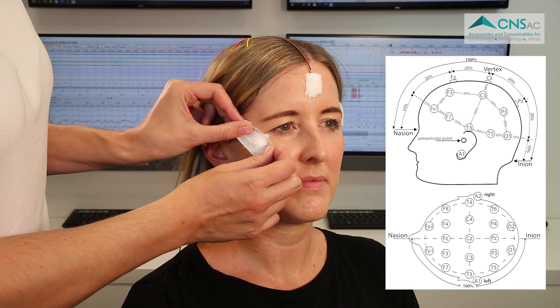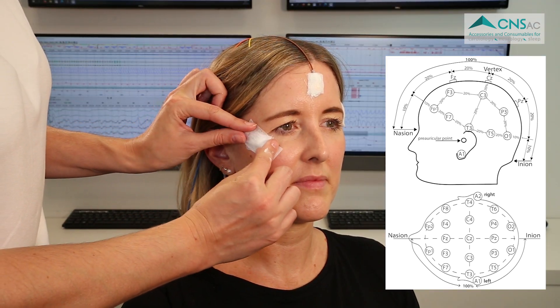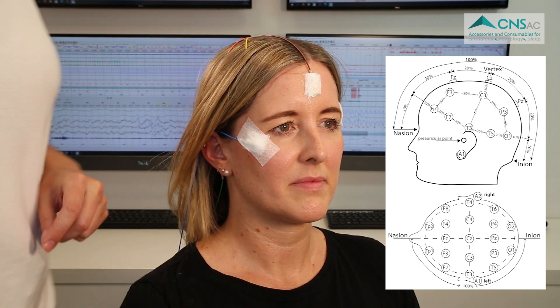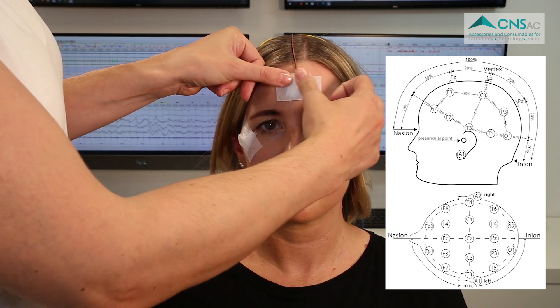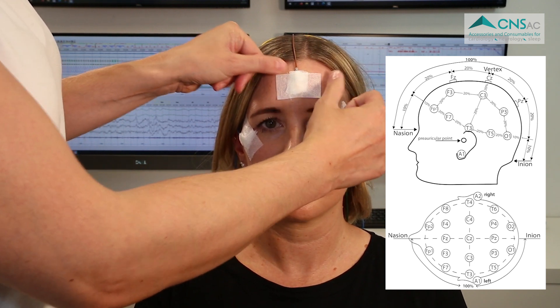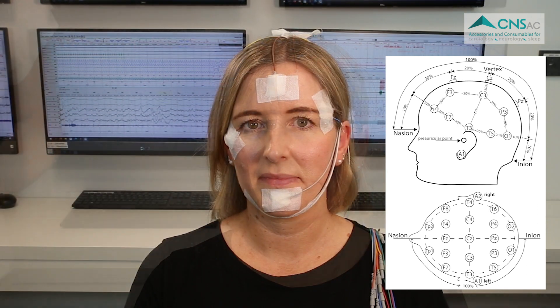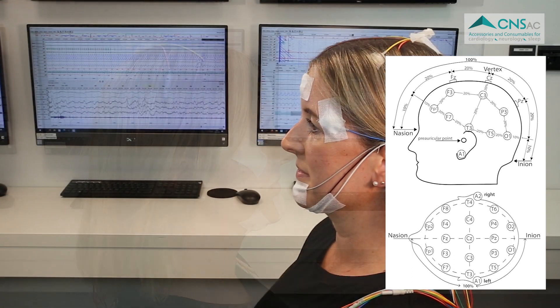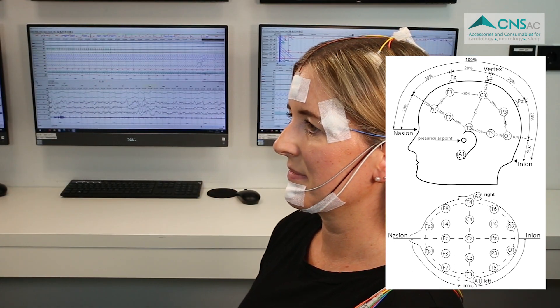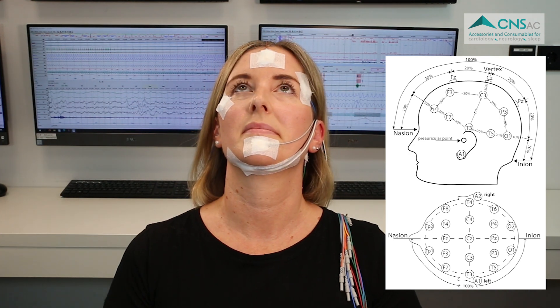For the cup electrodes on the facial area, you can secure them additionally using a skin-friendly tape over the gauze and electrode as demonstrated in this video. Make sure that all electrodes are securely attached and arrange the cable so that there's no tension on the individual electrodes in order to avoid any failure during PSG or long-term EEG monitoring.